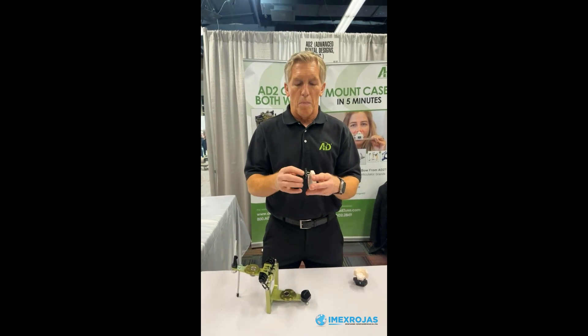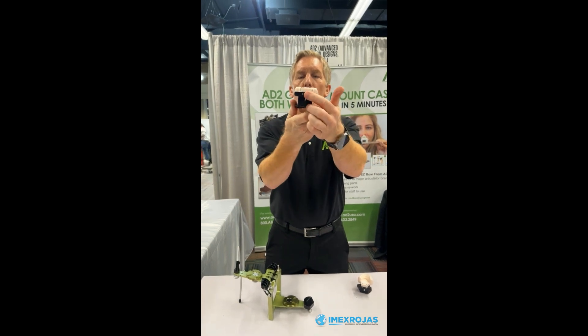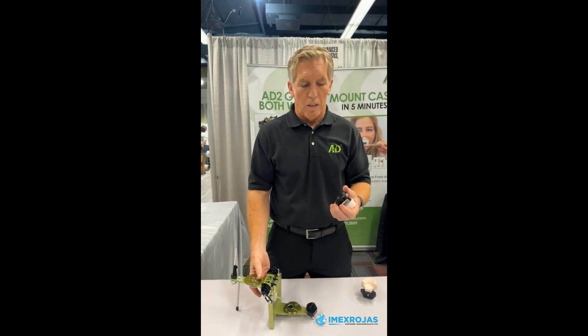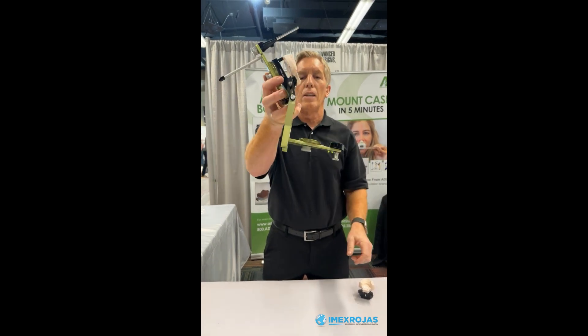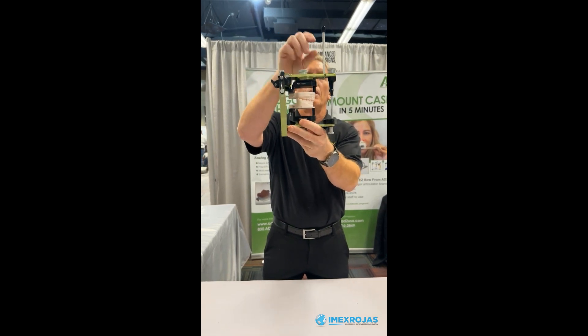We're going to do the same thing with the upper model now. You're going to load it right onto the pins and press it until that model is flush to the back. Likewise, you've got a nice contact in the front, and putting it on the articulator is as easy as mounting the magnetic mounting plates. The upper mounts just like that, and the lower snaps on just like that, and you can go ahead and close and you're all good.